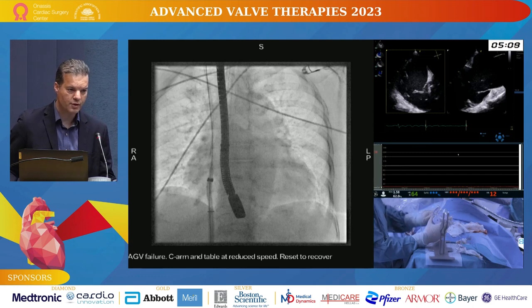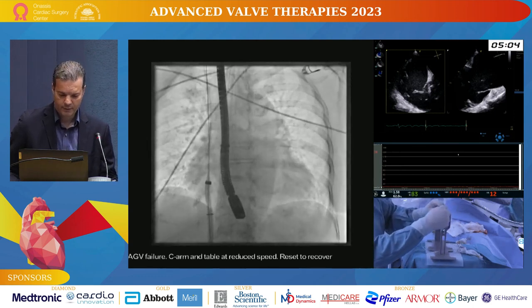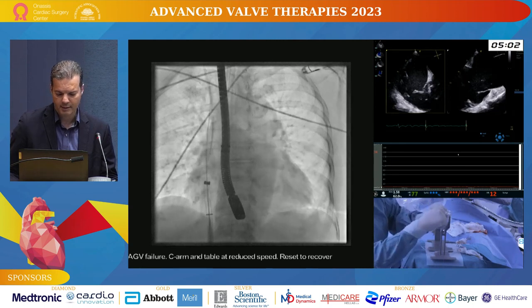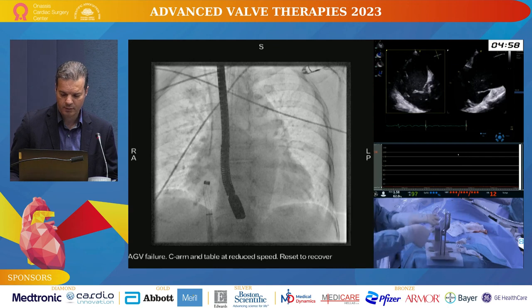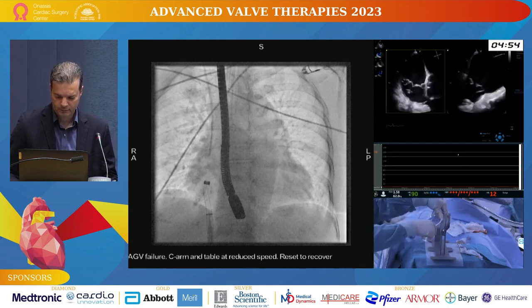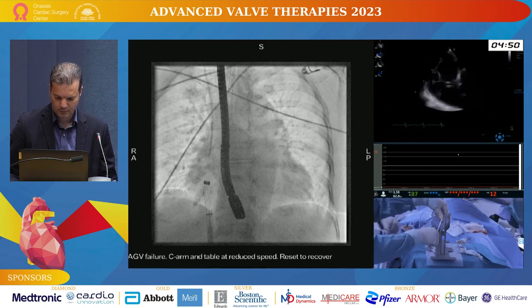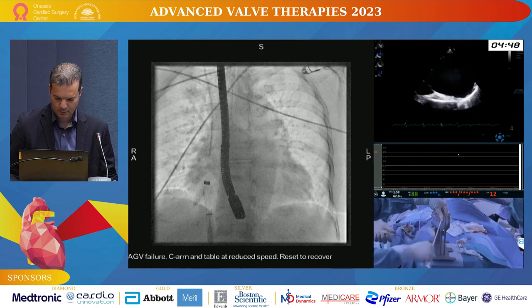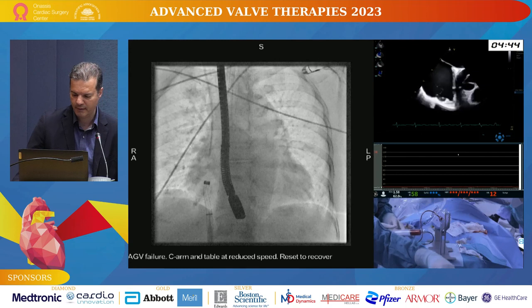It's the same process that we do for the mitral valve. Make sure we do de-airing. So dilator comes back, wire comes back, and then with aspiration, we will remove the dilator. Dilator comes back, aspiration of blood, and then flush.